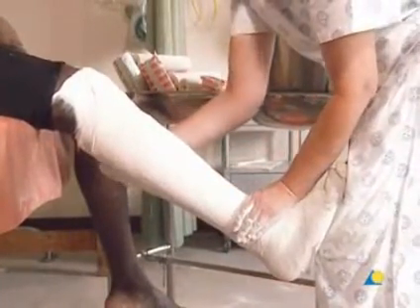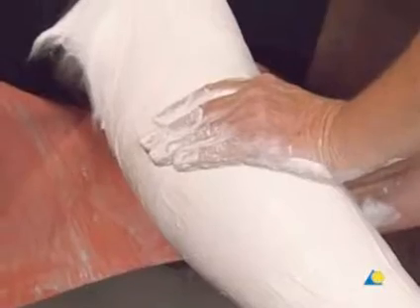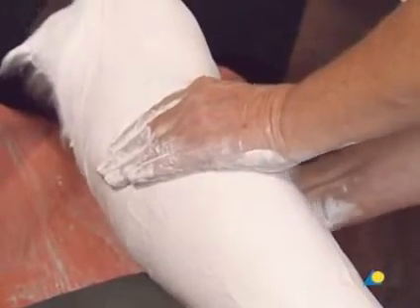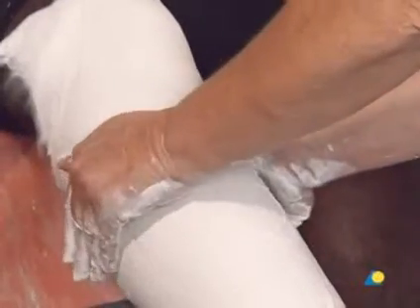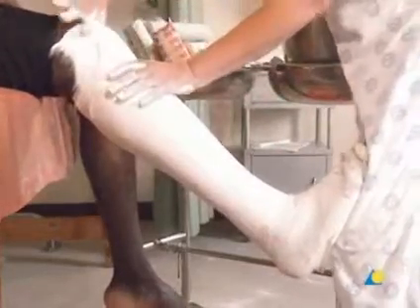Moulding begins with one hand applying strong pressure between the heads of the gastrocnemius muscle as shown. The other hand molds plaster around the wings of the tibia. The thumbs are then used to mold around the wings of the patella and the quadriceps implantation area. Downward pressure is applied to the top of the patella with the thumb and forefinger, while the bottom of the patella is supported with the other hand.